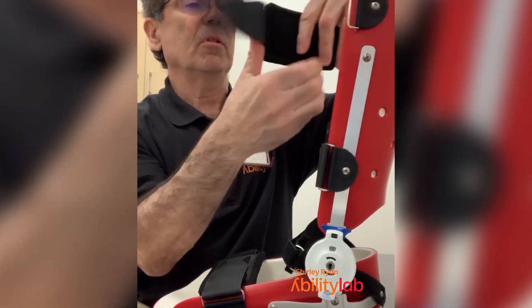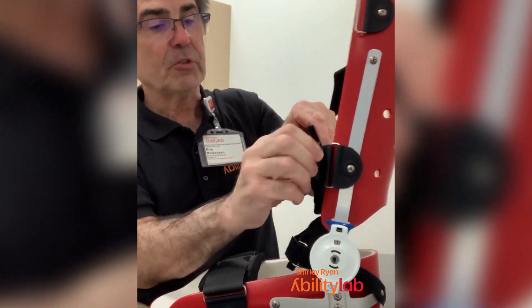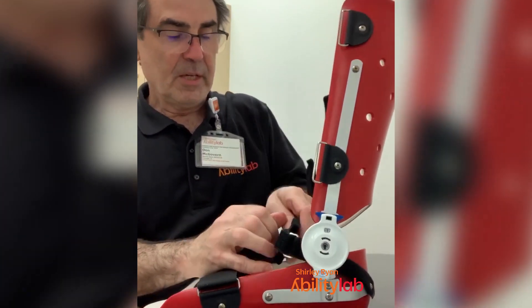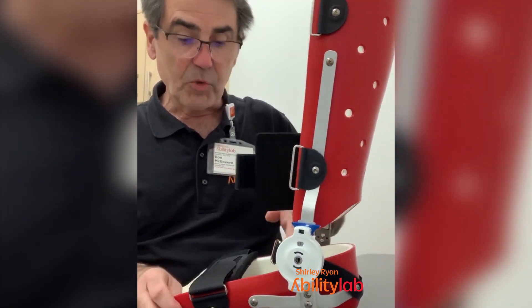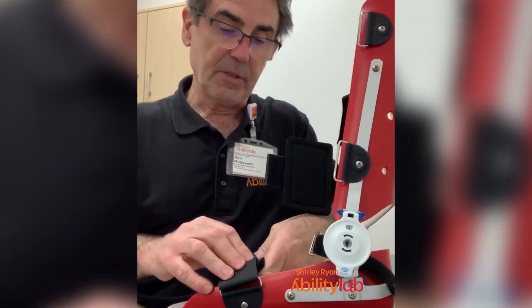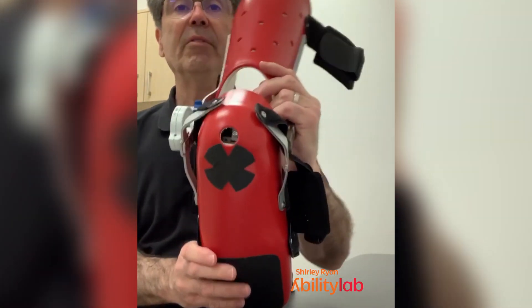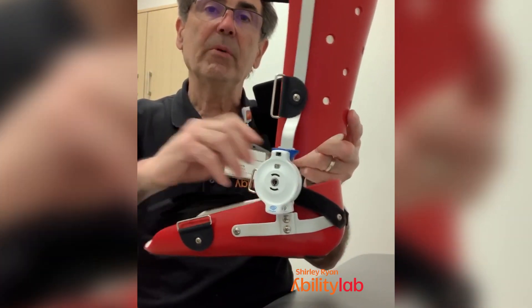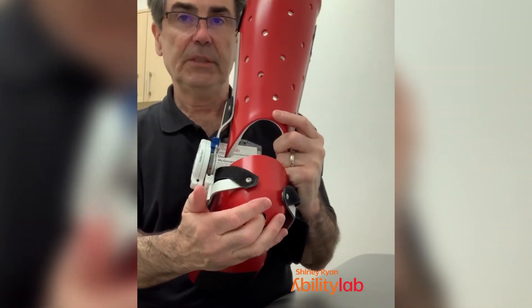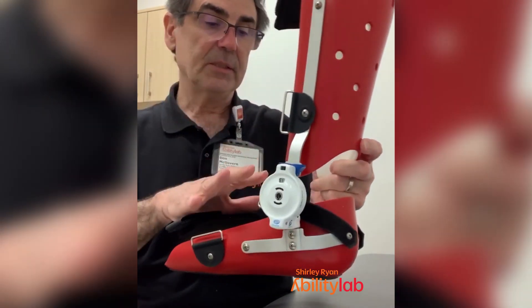We're going to open up the Velcro — there are four straps usually. These are all made per individual, so for you it might be a little bit different than for somebody else. There's a heel hole in there, so when the foot goes in, you want to make sure the heel is all the way down in there completely. You don't want any gapping, at least initially.